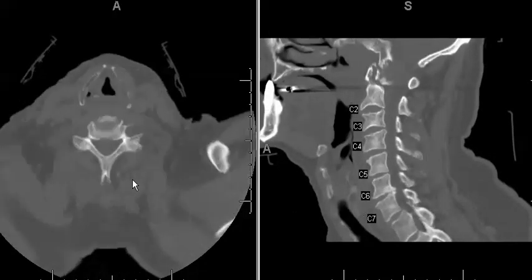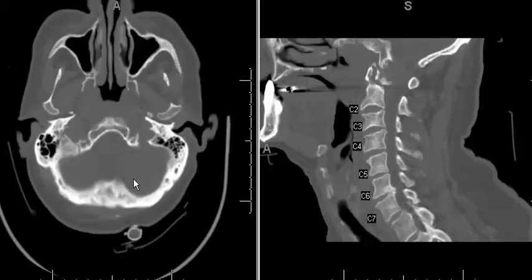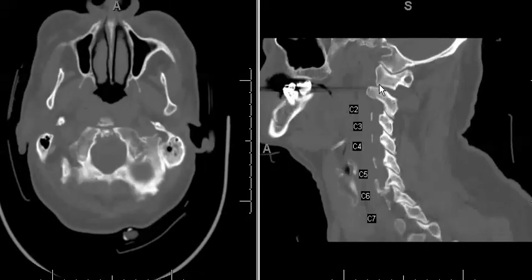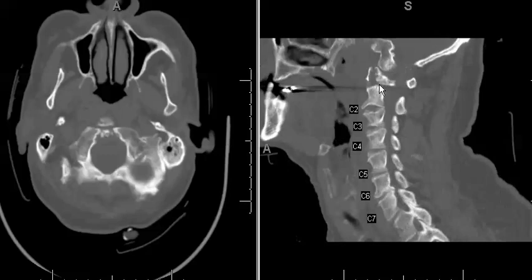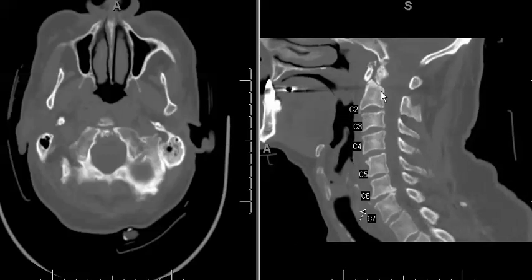When assessing a C2 fracture, it is important to note there are three types of C2 odontoid fractures. A type 1 fracture is an avulsion fracture along the odontoid tip. A type 2 fracture involves a fracture along the base of the odontoid process. The type 3 fracture is an oblique fracture through the base of the odontoid extending into the C2 body.